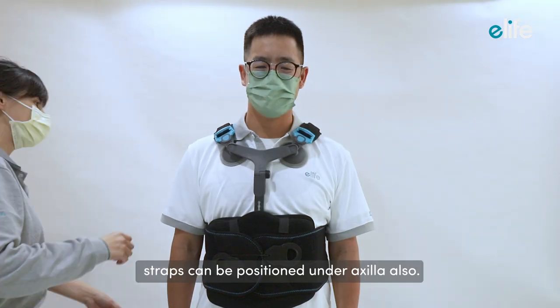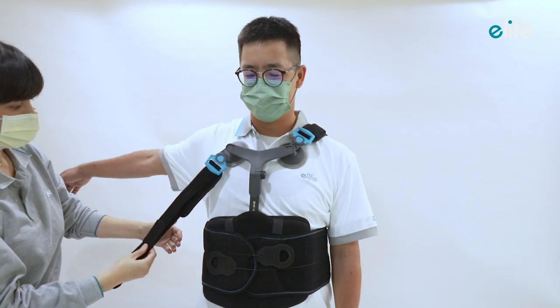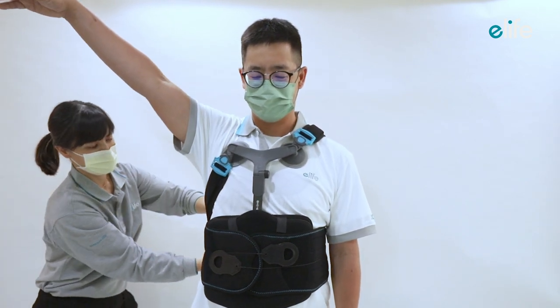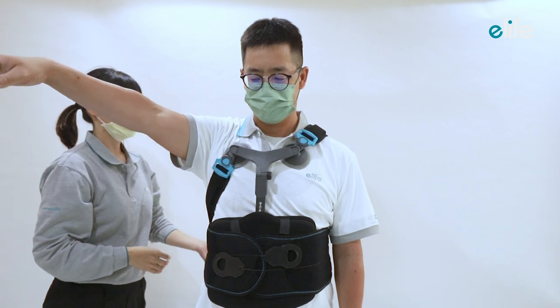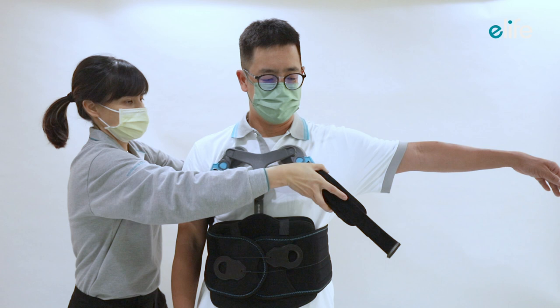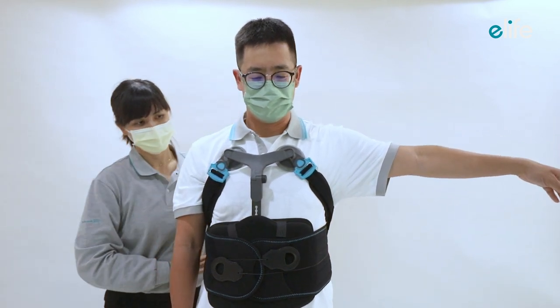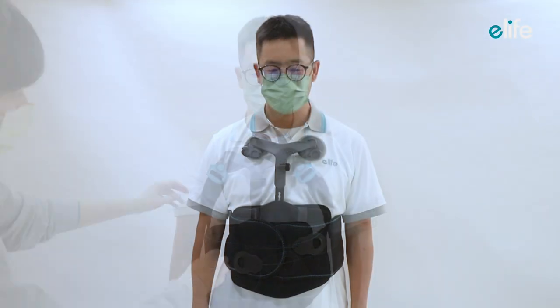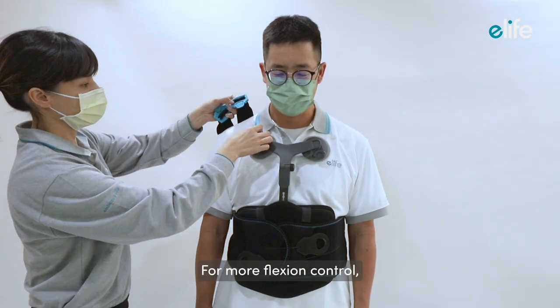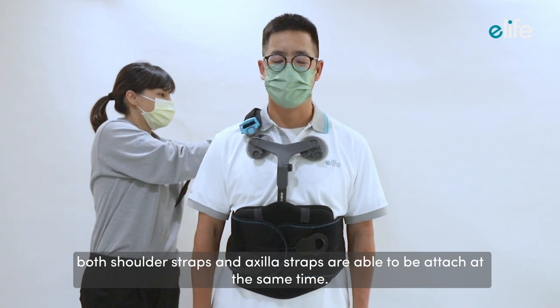Straps can also be positioned under the axilla. For more flexion control, both shoulder straps and axilla straps can be attached at the same time.